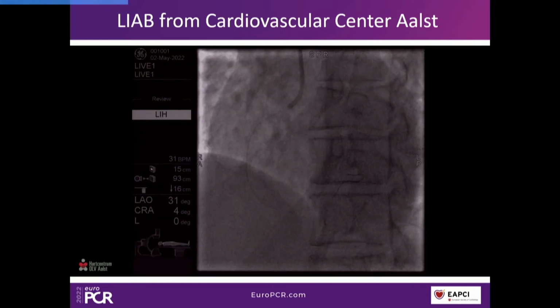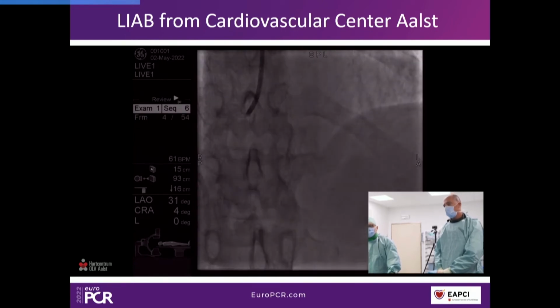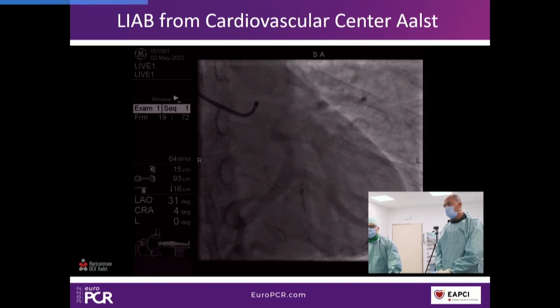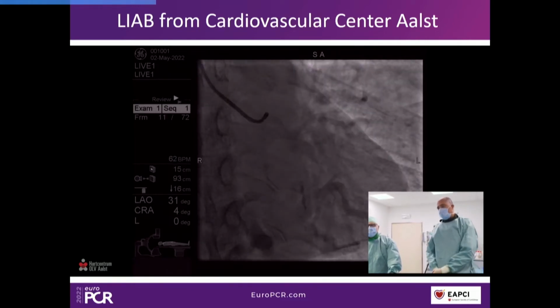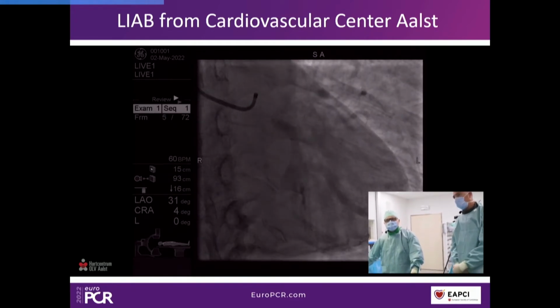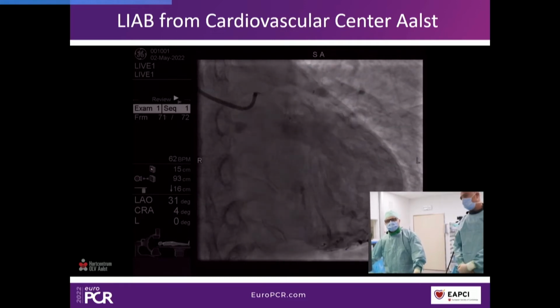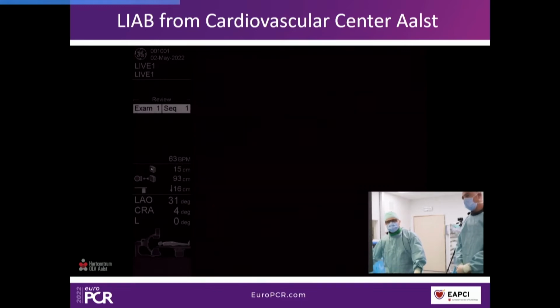While going live, we collected some baseline angiograms that we were discussing with Jeroen. Let me go all the way back to the left coronary artery first. We have already an intermediate lesion on this marginal branch, Jeroen. Indeed, so it's a very focal lesion, appears to be focal, not so severe, if you ask me, but nevertheless we will interrogate and assess this one indeed using FFR.